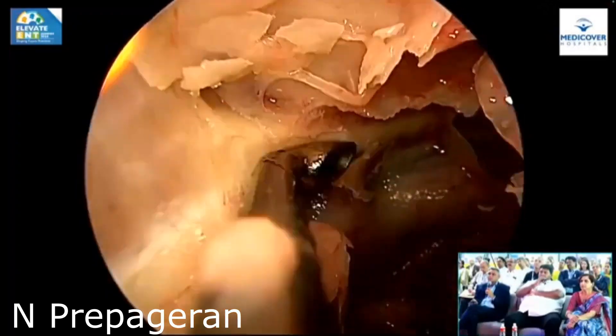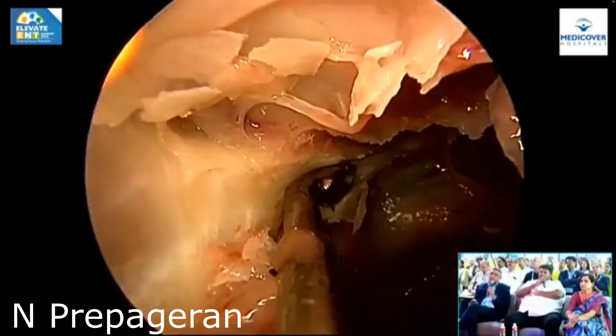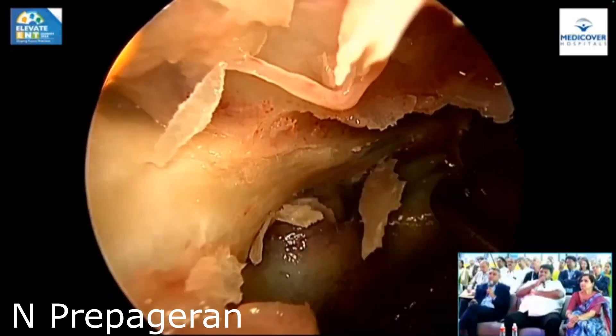So this is orbital decompression? No — optic. It's optic decompression, until you open the perineural sheet.